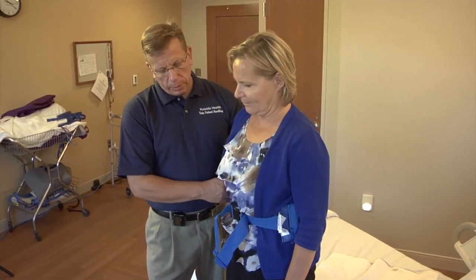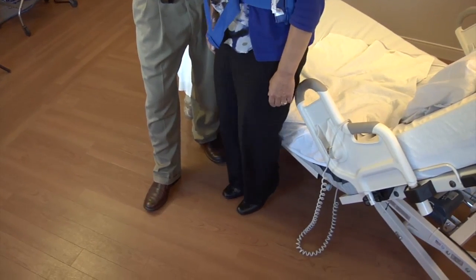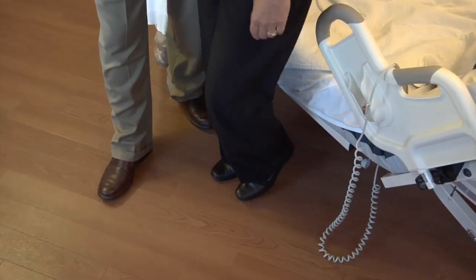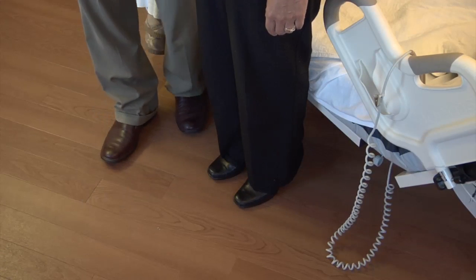Assessment and taking your time to determine how well this patient is ready to move is going to prevent a lot of accidents and prevent a lot of incidents of patients buckling. Notice that patient did not take steps until we were sure that they were stable and able.